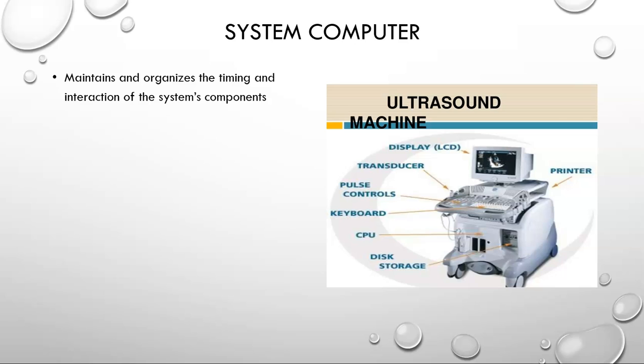Controlling all of this, synchronizing all the different functions is the system computer. This maintains and organizes the timing and interaction of all the system components.